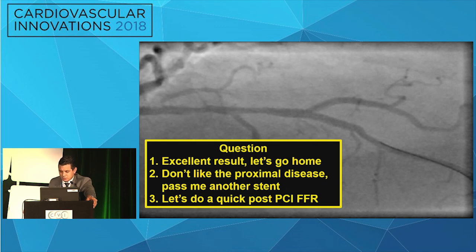So now the question is, are we done? Let's go home. I don't like the proximal disease, pass me another stent, or let's do a quick post-PCI FFR. Any thoughts from the panel? Yeah, this calls for more FFR.